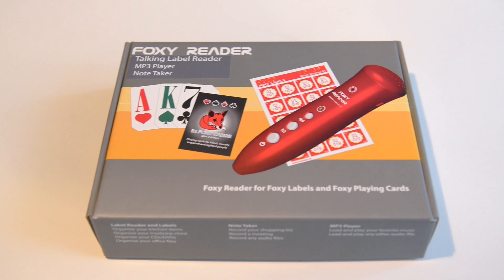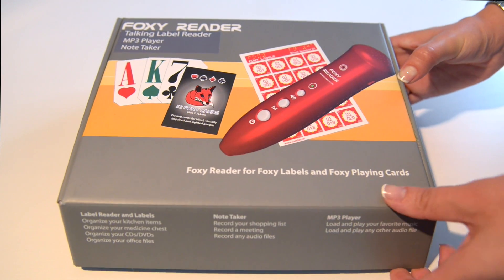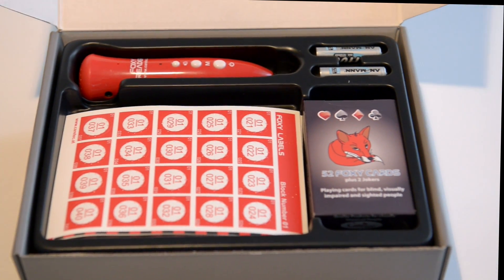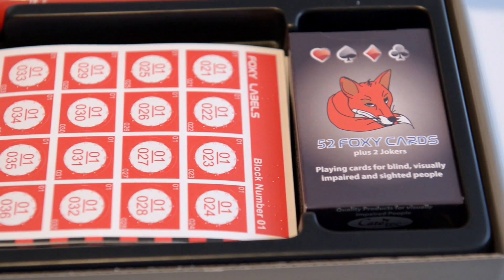Foxy Reader, the latest high-tech product for blind and visually impaired people by CareTech. Let's take a closer look. The package includes the Foxy Reader, Foxy Labels and Tags, and Foxy Cards.